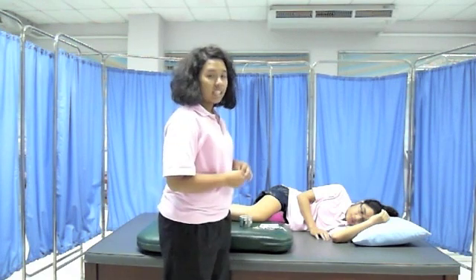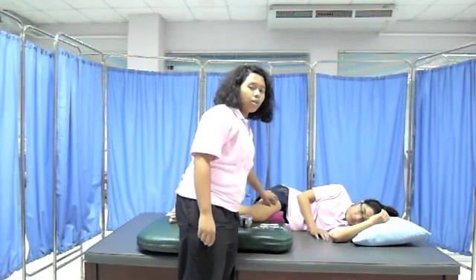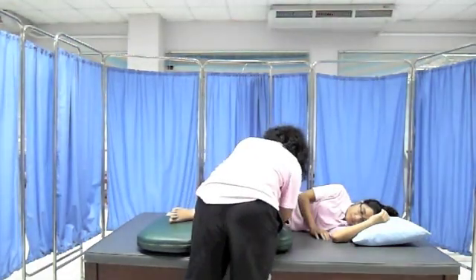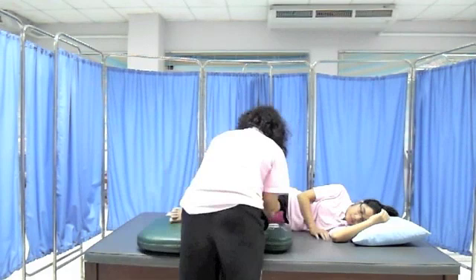Before I use the electrical stimulation on the second area, I will use alcohol to clean and reduce the resistance of the skin. In this case, we apply alcohol on the area of the gluteus muscle, the quadriceps, and the tibialis anterior. Then I will place the electrode on the muscle.